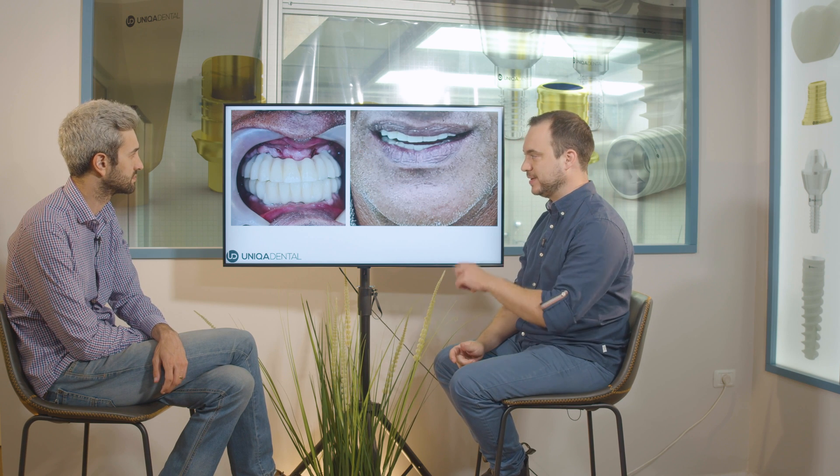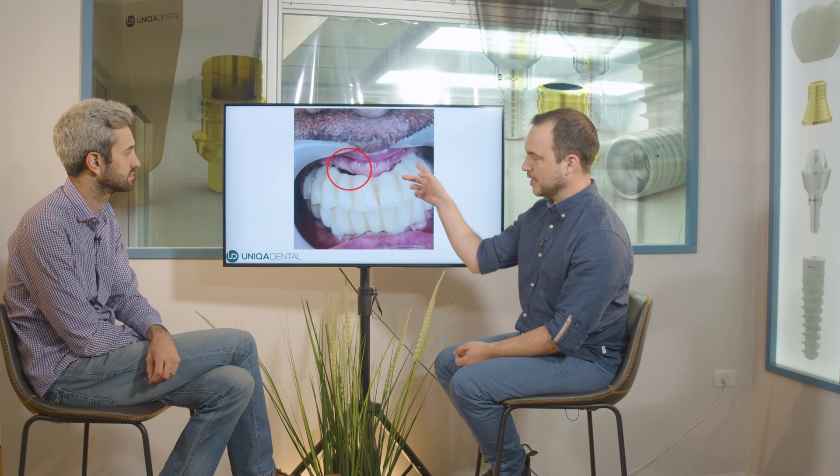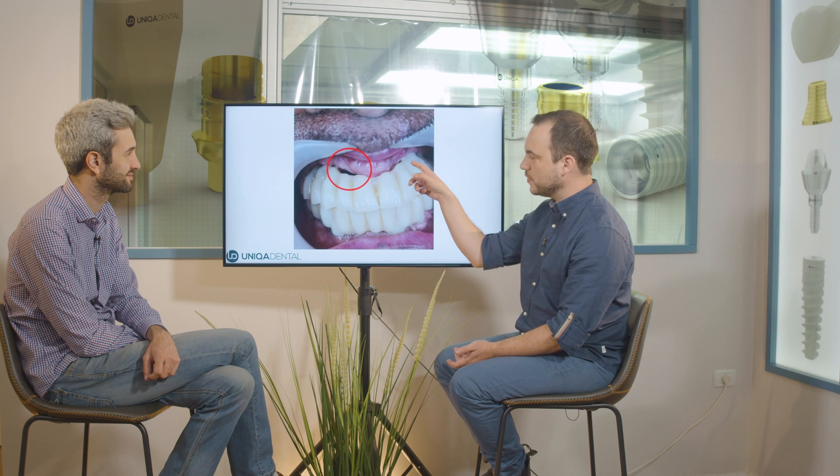Here you can see the occlusion. We made the upper teeth a little smaller and the lower teeth a little higher based on his smile line. There was still some inflammation where the other implants had been, so we needed to wait for the healing process to complete. After healing, a space appeared in the area that had been inflamed. The bridge itself is fine, the central line looks good, and the patient is very satisfied.